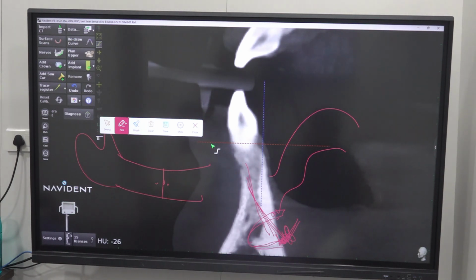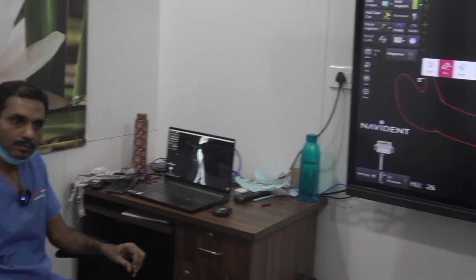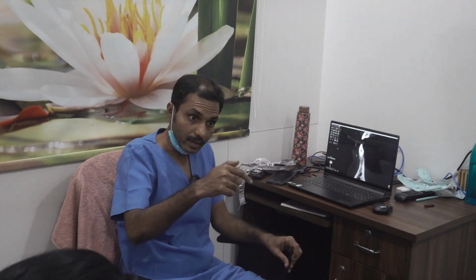Okay, so, lingually, there was very heavy bleeding, which I controlled almost 15 to 20 minutes later. Like, from the LA injection site? Yes, injection site, and I broke the bone. And while I was elevating, I did something unusual. So, lingual side, there was very heavy ooze out. See, it is open. You are doing cautery and all. When it is closed, it elevates the tongue and all.